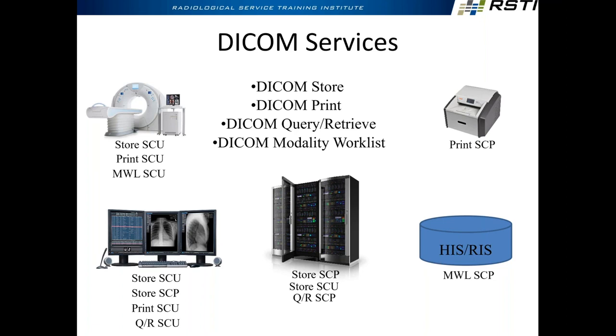Work list provider, work list user, client server. Does that make sense? That works, right? That's good there.